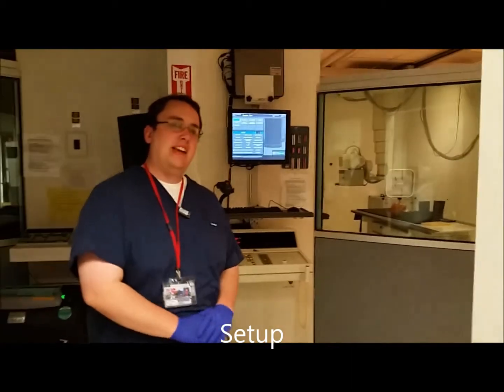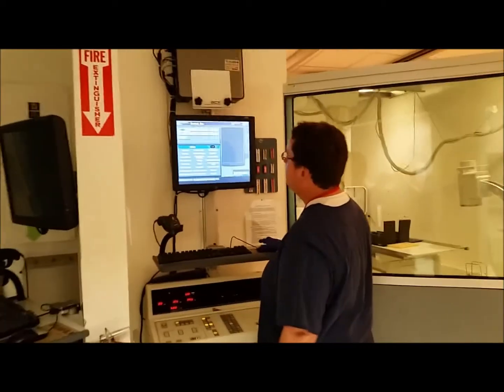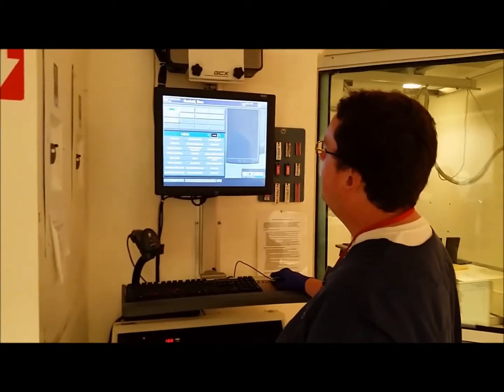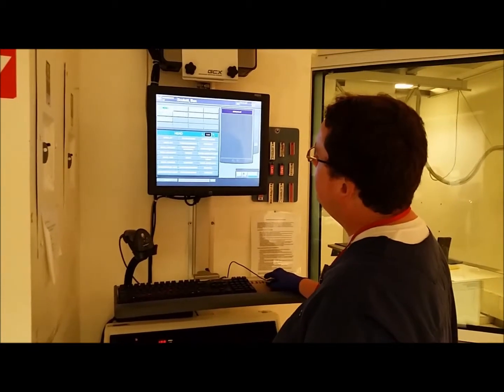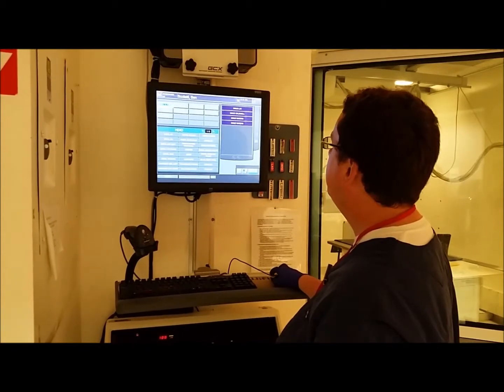Okay, we'll be performing a sinus exam today. So first thing, I want to go over here, select what we're doing on the computer here. We'll start out with a sinus lateral, do a sinus Caldwell, and then 2 sinus waters here. Start study.